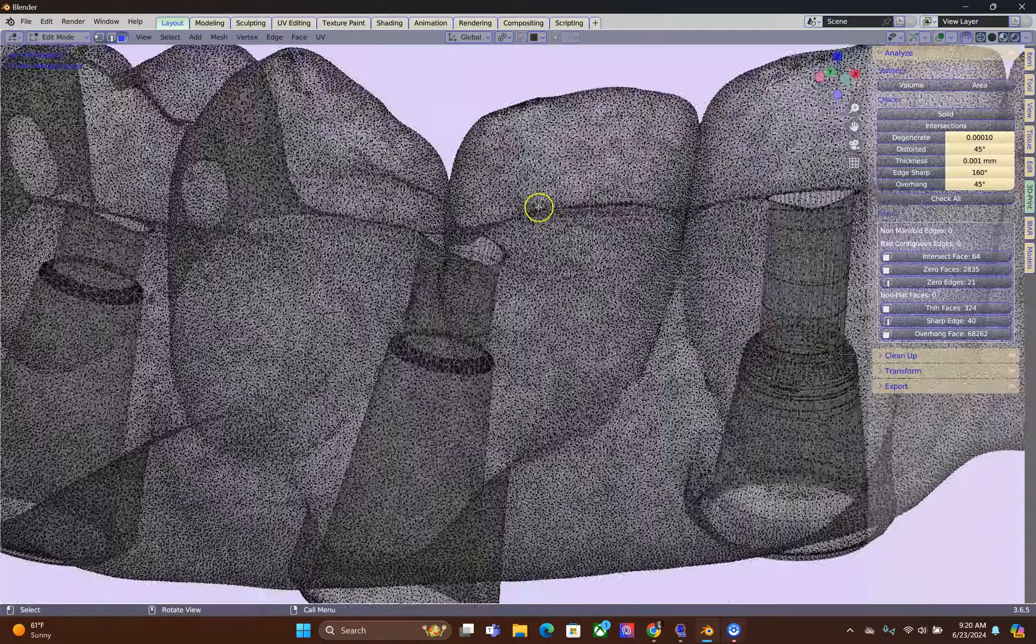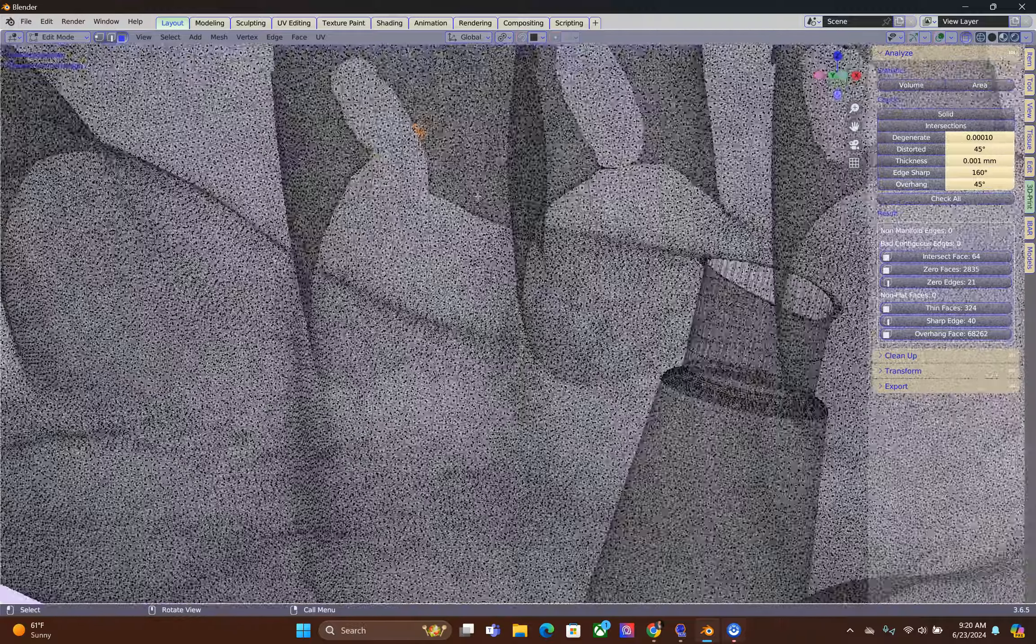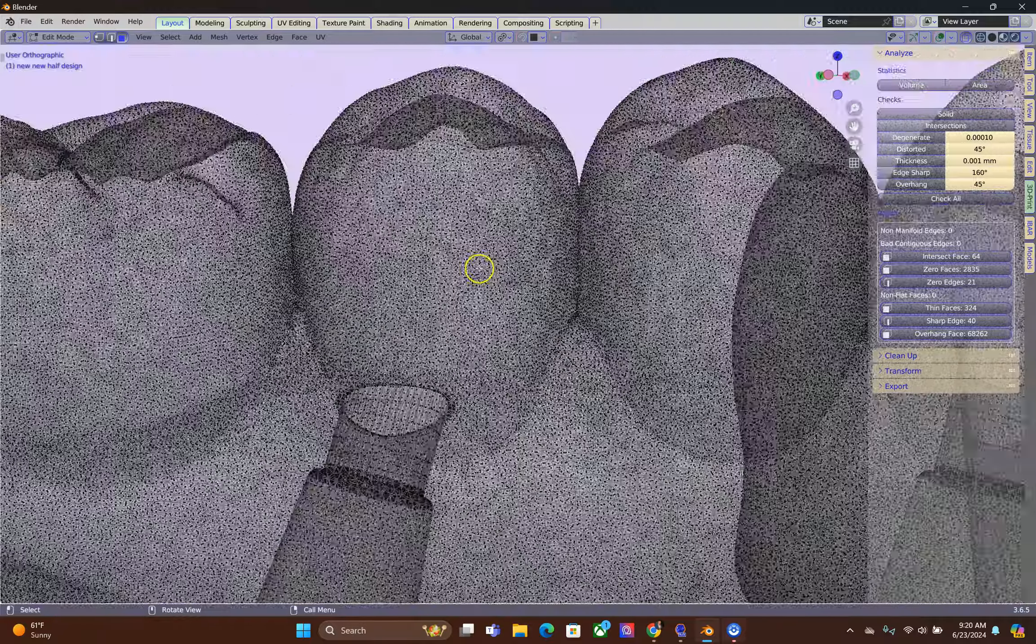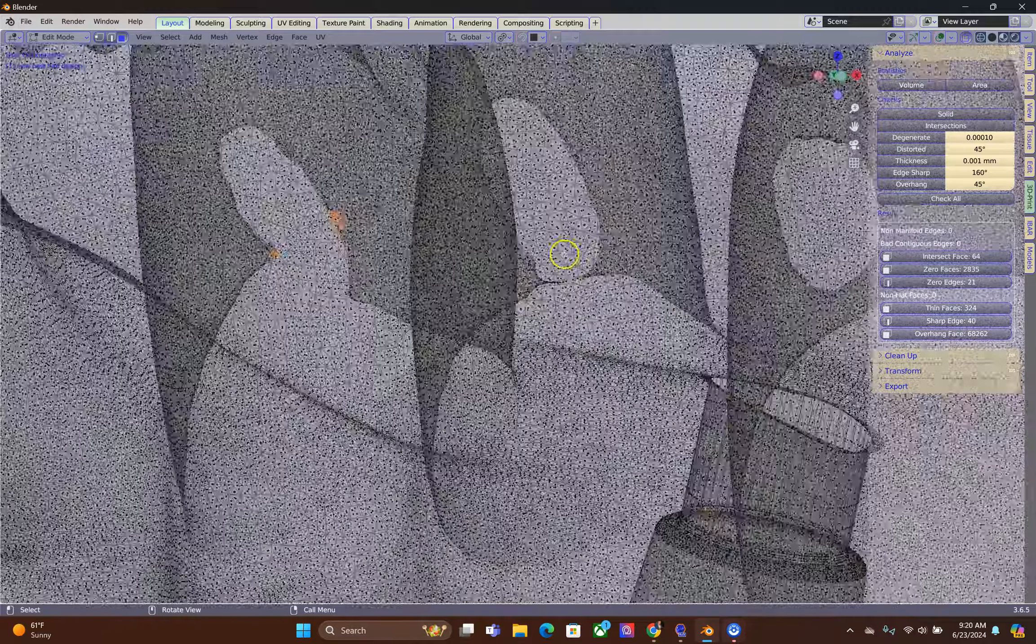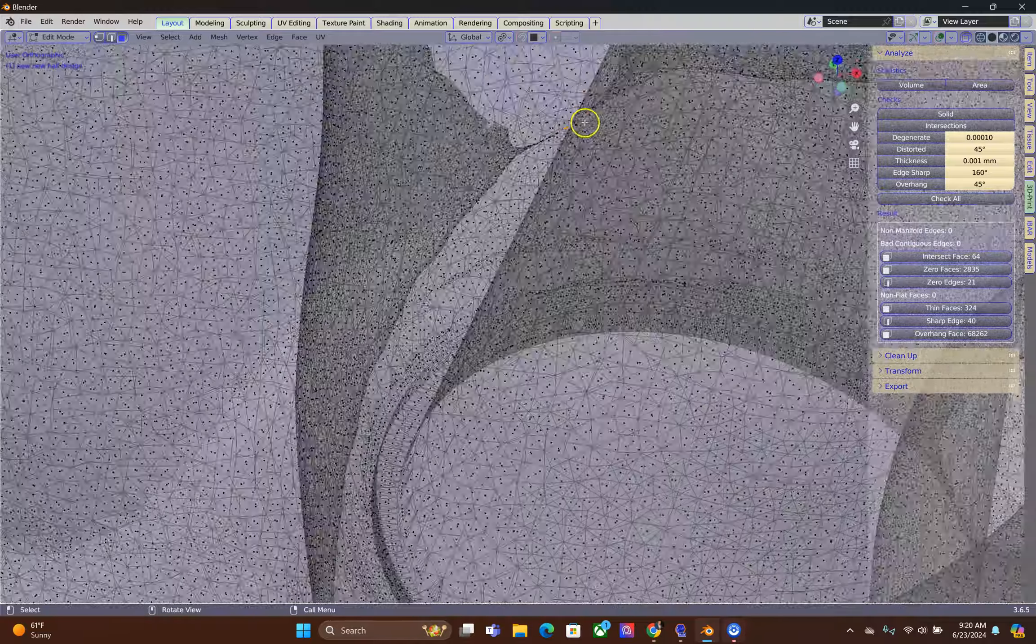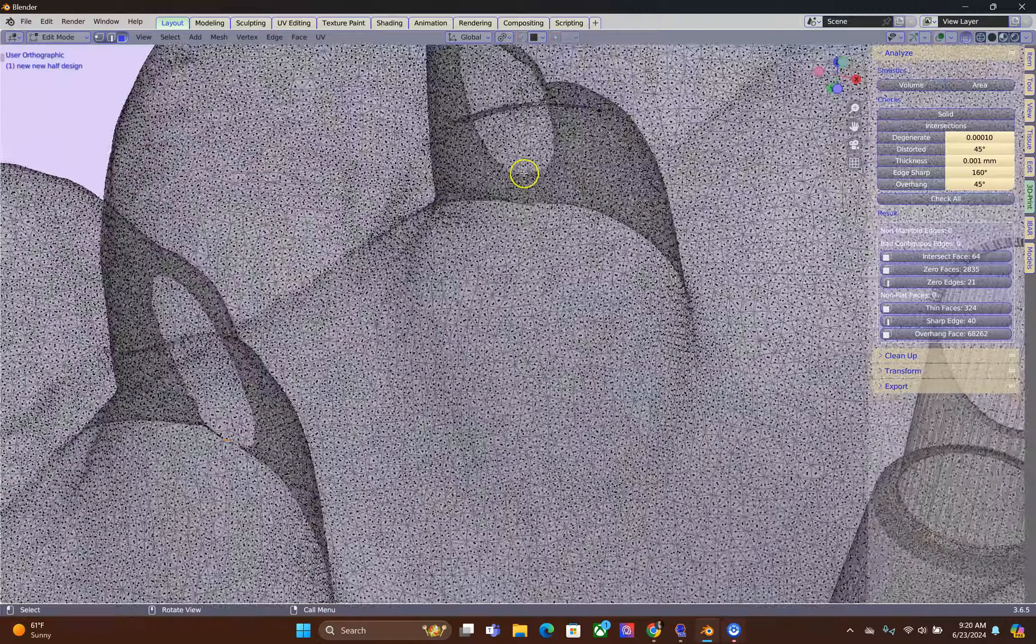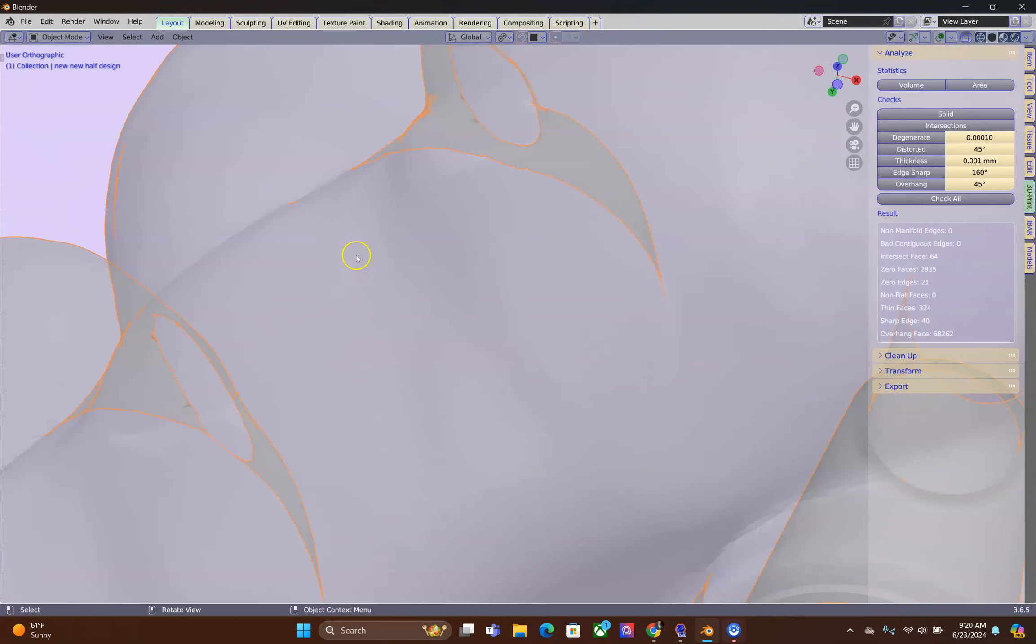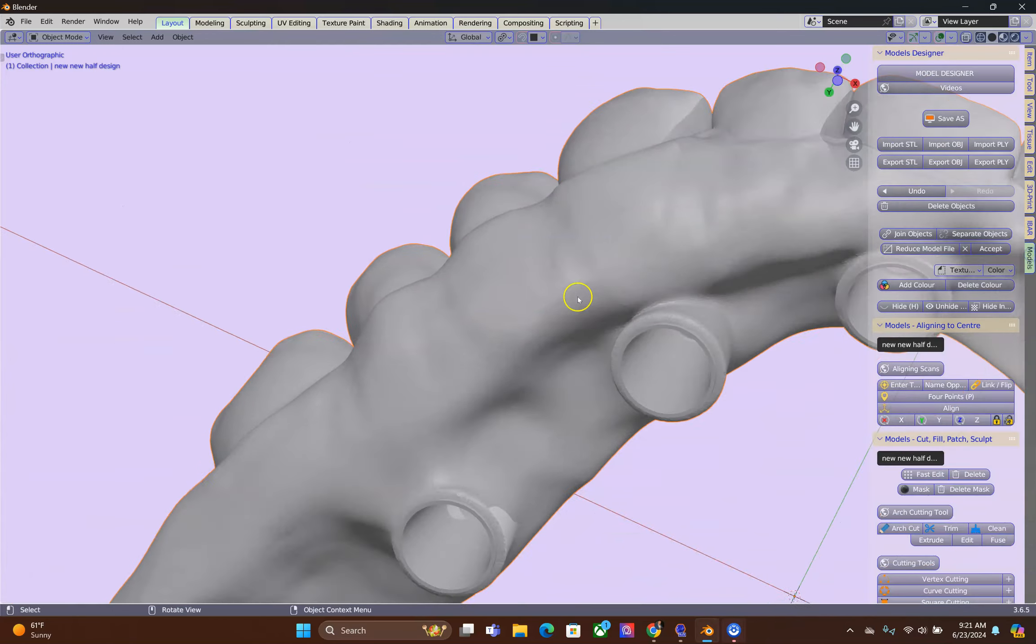Now this one has been designed quite well, we've got a few intersections interproximately over there. Also, if you note, we've got the contacts which are not good. We need to make sure that we've got enough space.